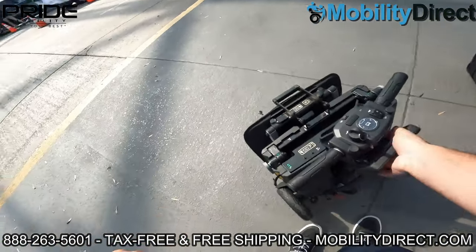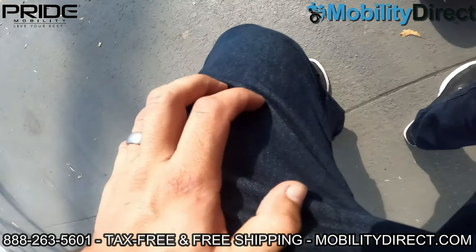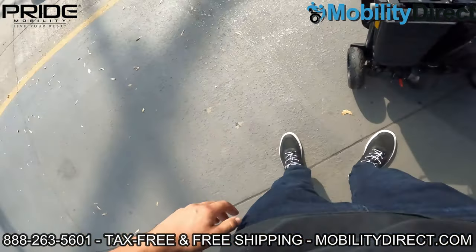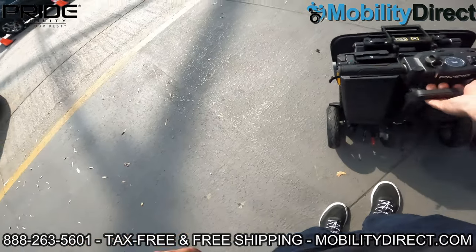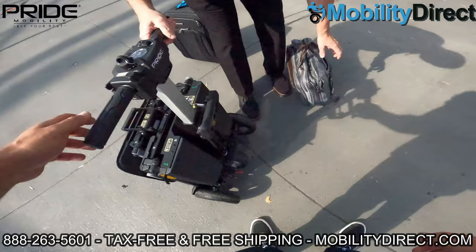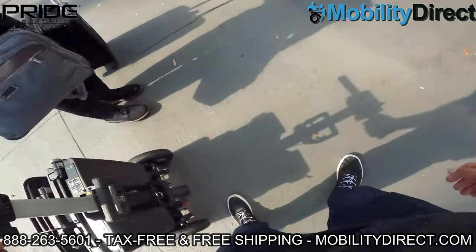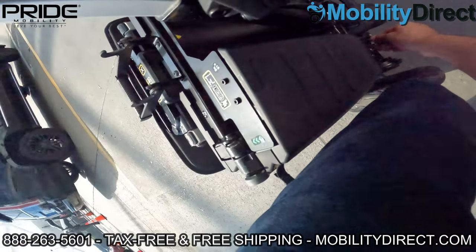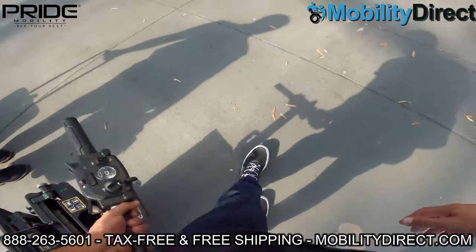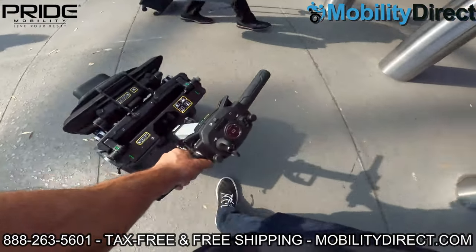A few quick specs about this scooter: it can hold up to 275 pounds, travels up to 4 miles per hour, has a 5-inch ground clearance, and can go up to 9 miles on a full charge. It does have an airline-approved lithium battery. Here we're showing you how to put it into trolley mode — you disengage the brakes using that red lever, and then you can carry it around like carry-on luggage with wheels.